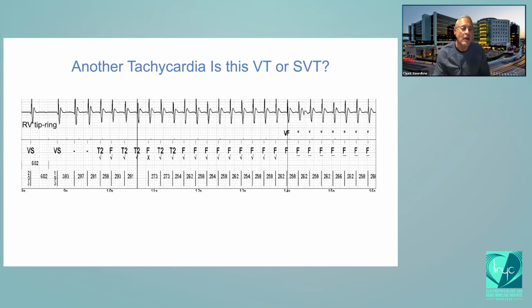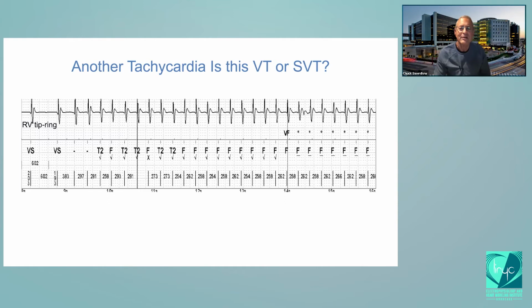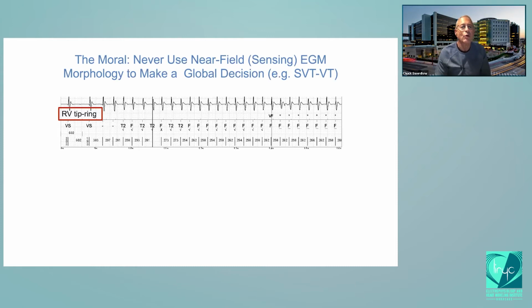So here's another tachycardia. Is this VT or SVT? Anybody want to say? Looks like SVT. Yeah, SVT. And that's because morphology looks the same, right? That would almost be true. But there is an important rule.